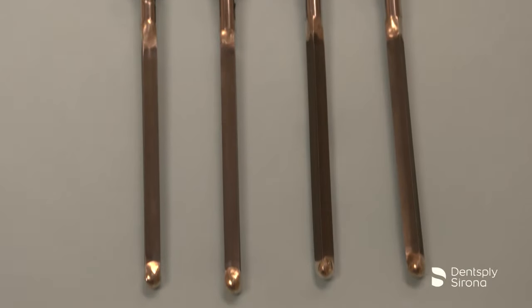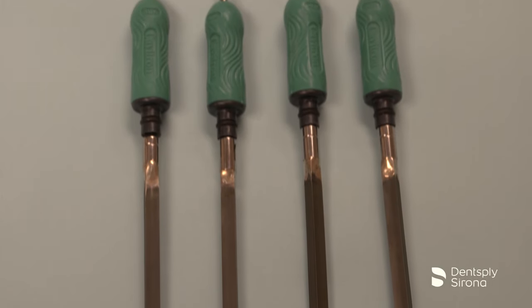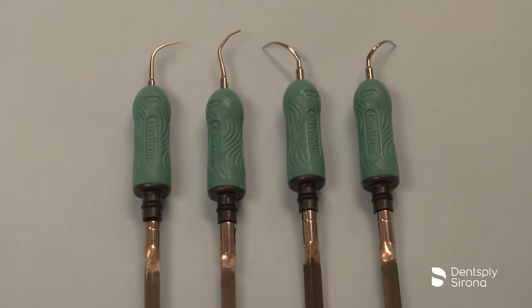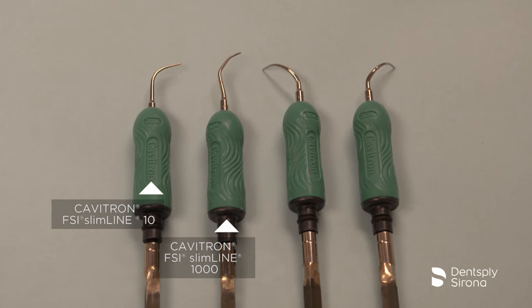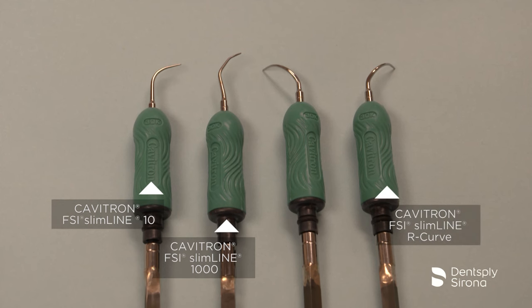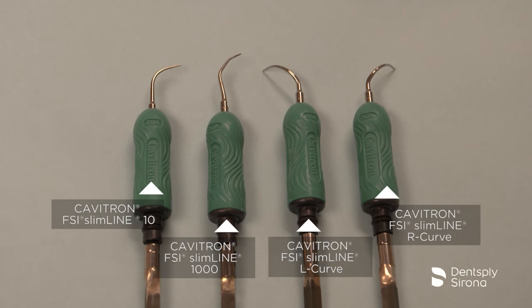There are four inserts in the Slimline family commonly used during periodontal debridement procedures: the Cavitron FSI Slimline 10, the Cavitron FSI Slimline 1000, the Cavitron FSI Slimline Right Curve, and the Cavitron FSI Slimline Left Curve.